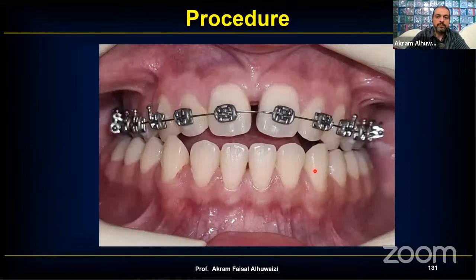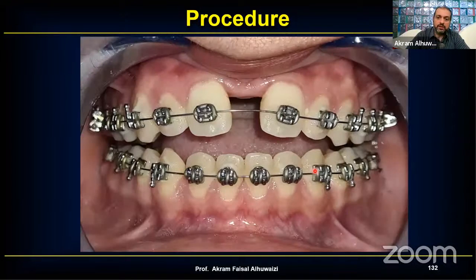Okay. So what's the procedure? This is a patient which has been inserted, and as you can see, it's expanded. Once it's expanded, I usually place fixed appliances and start to close up what has remained. In many cases, I would find there's a little bit of an open bite anteriorly due to change of the intercuspation of the posterior teeth. I don't think there's a lot of extrusion going on the 6s, since they are flexible arms, but probably there's a little bit of extrusion.